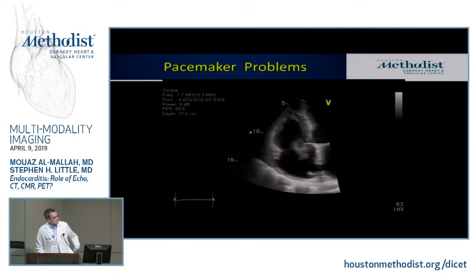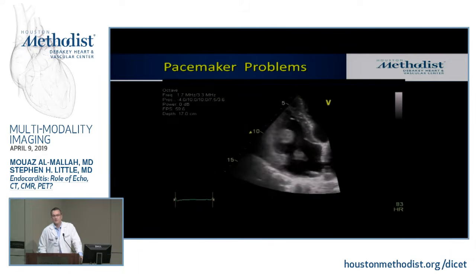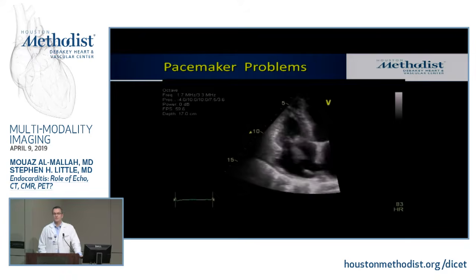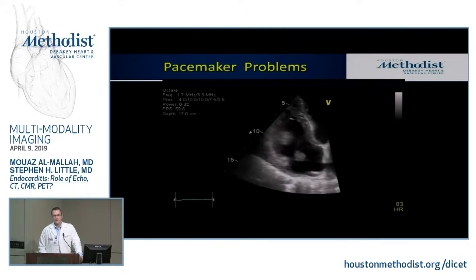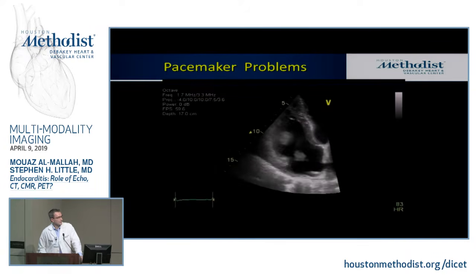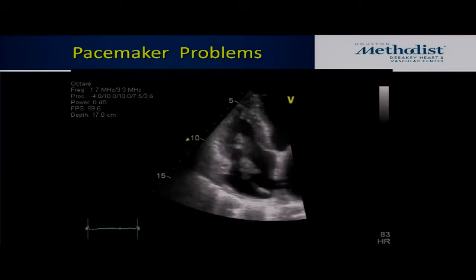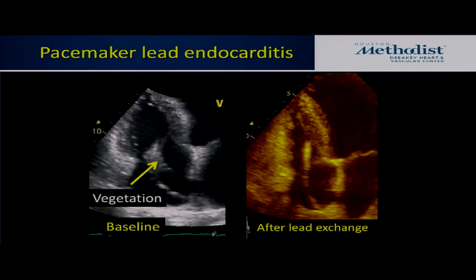So this is a tricuspid valve, massive amount of stuff on here. And at first blush, you would think it's too big to be a vegetation. It must be a thrombus or some ugly malignancy. But once you have prosthetic material, again, those sort of rough rules about size and how big something can really grow don't exist. So this is a pacer wire all the way through, and this is a large Staph aureus collection adherent to a pacer lead. And simply, remove the pacer lead, and that problem solved.